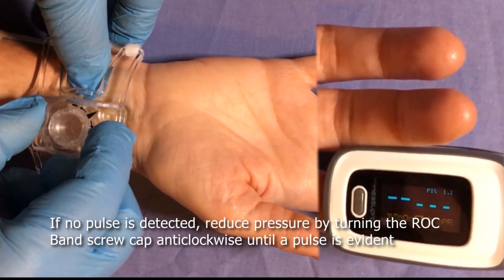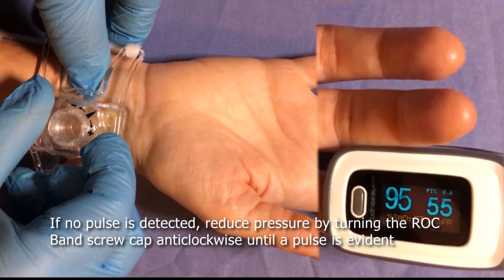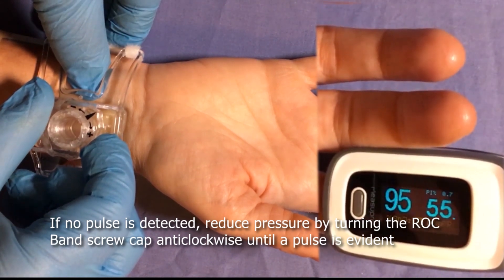If no pulse is detected, reduce pressure by turning the ROC Band screw cap counterclockwise until a pulse is evident.